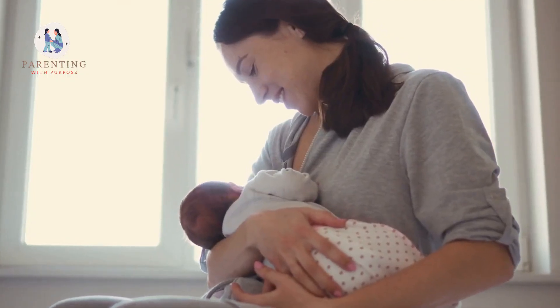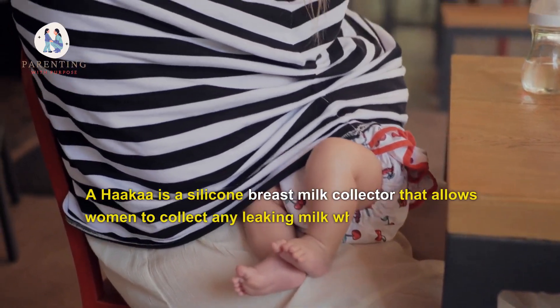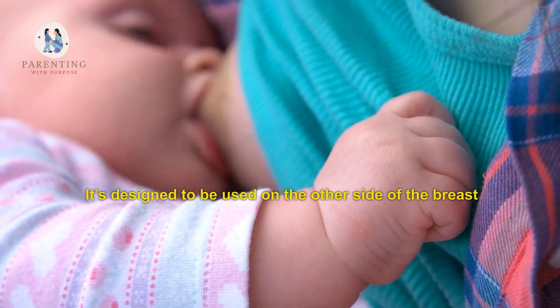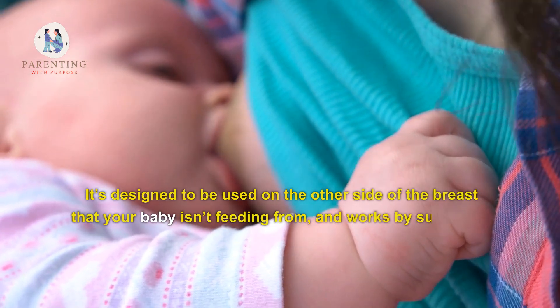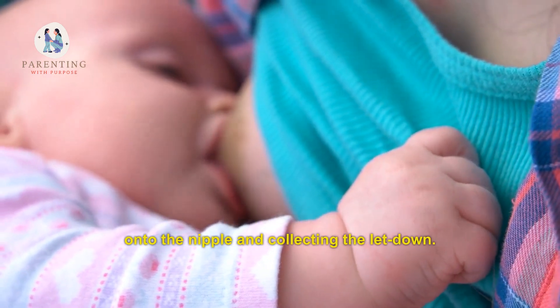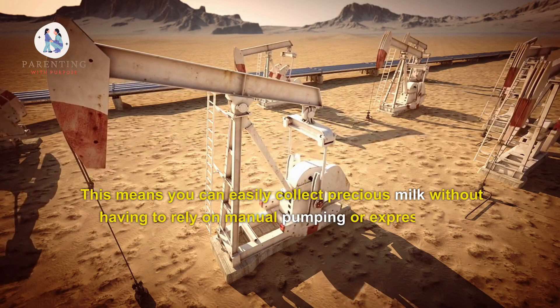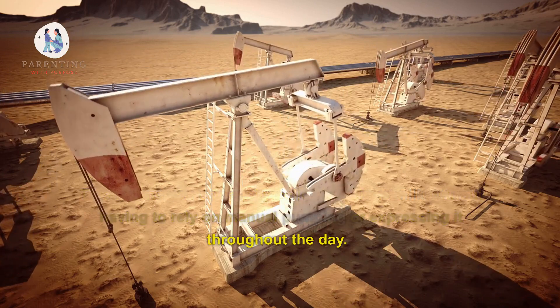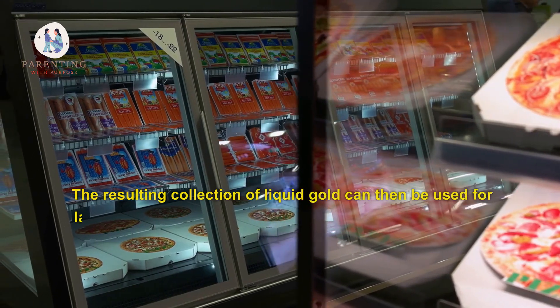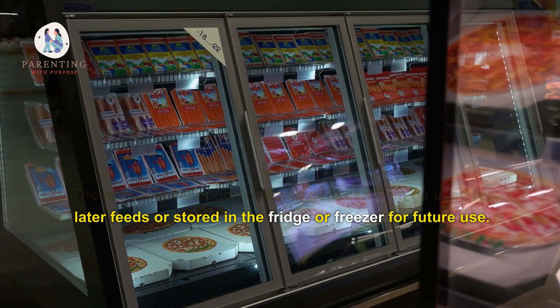A Hakaa is a silicone breast milk collector that allows women to collect any leaking milk while breastfeeding. It's designed to be used on the other side of the breast that your baby isn't feeding from, and works by suctioning onto the nipple and collecting the letdown. This means you can easily collect precious milk without having to rely on manual pumping or expressing throughout the day. The resulting collection of liquid gold can then be used for later feeds or stored in the fridge or freezer for future use.